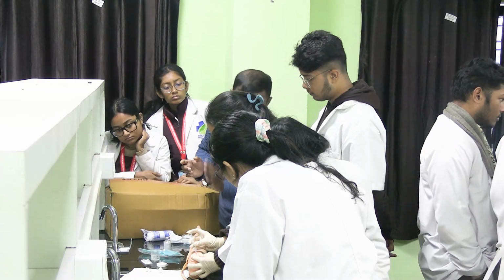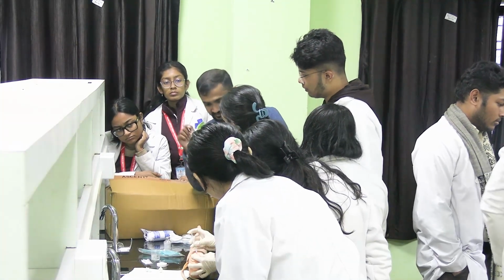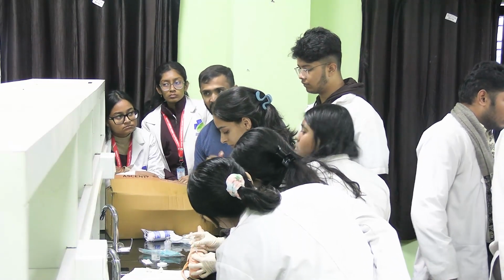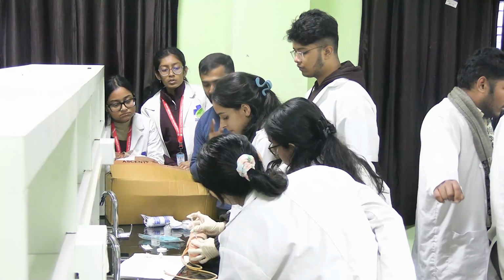Insert it. Wait. Now, what is the next step? Check. This one has to be quick and firm. Insertion of the needle. Then we'll check. You have to check. Okay. Here also you have to check.